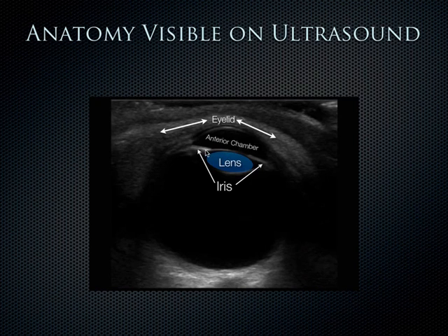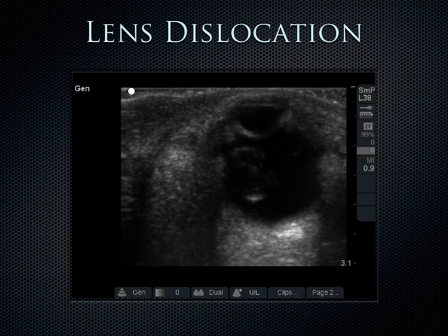And so what happens is when you shine light in the other eye, the eye that's open, you can actually see this iris constrict. And the pupil will constrict because this structure here and this structure here will move towards one another. And then you want to look in the posterior segment, sometimes called the vitreous body, or vitreous humor, and then behind that is the retina attached down at the choroid. And actually behind the retina, you can see a little piece here of the optic nerve sheath coming down as well. And we can see all kinds of cool stuff.